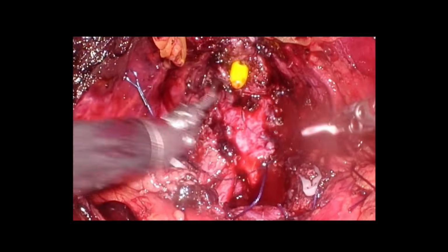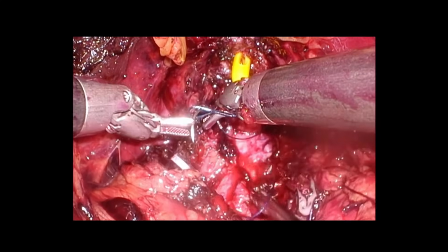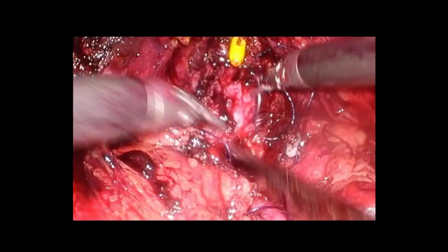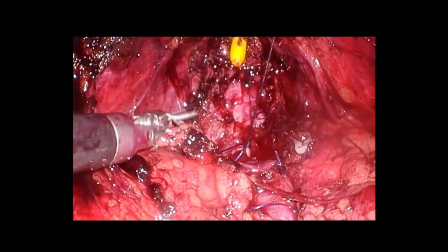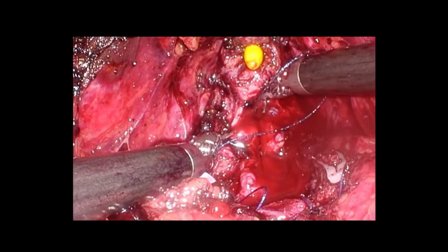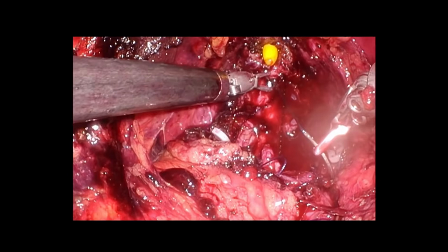Following this, the Rocco stitch is taken. The fibromuscular tissue in the retrourethral area is taken first, along with generous bites from the Denonvilliers' fascia. 2-3 layers are taken so that a good approximation of the urethra to the bladder neck is possible.